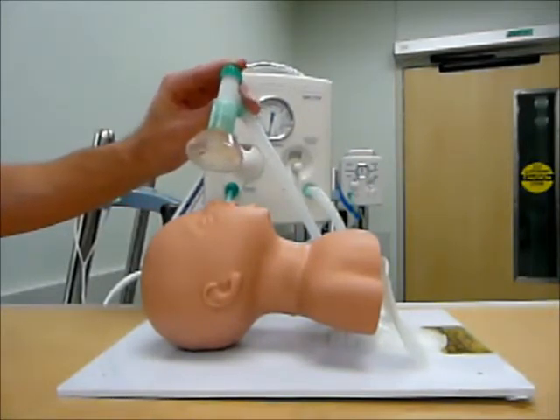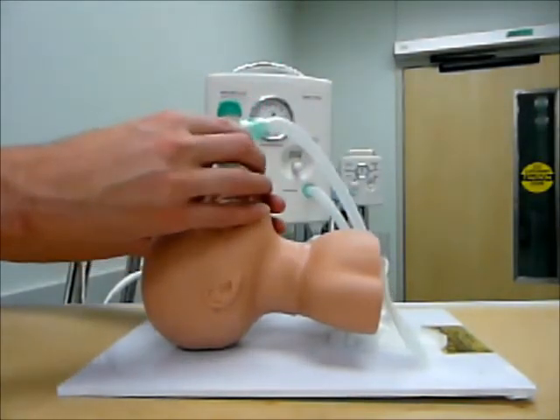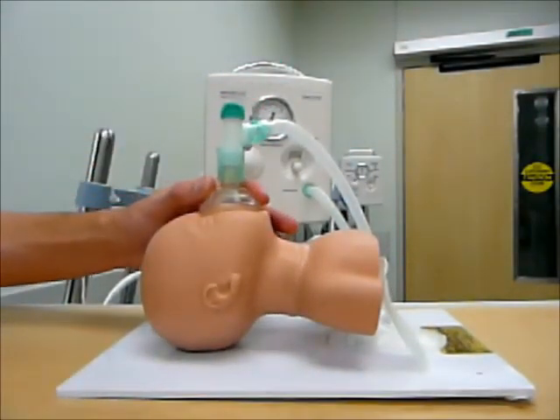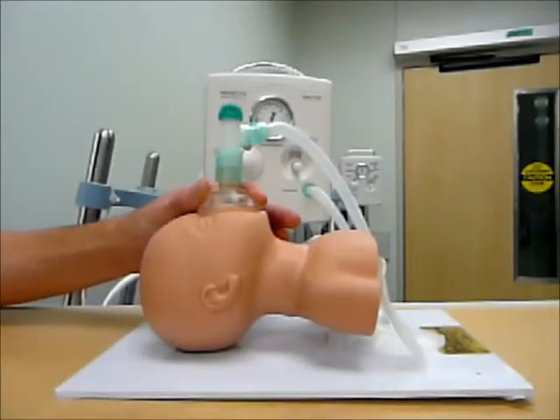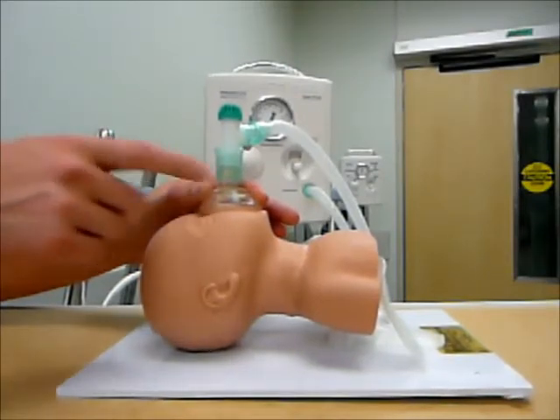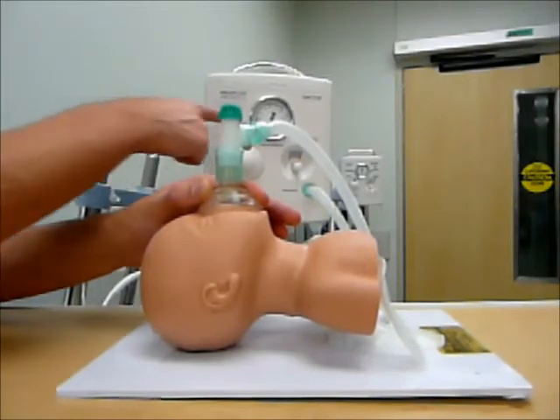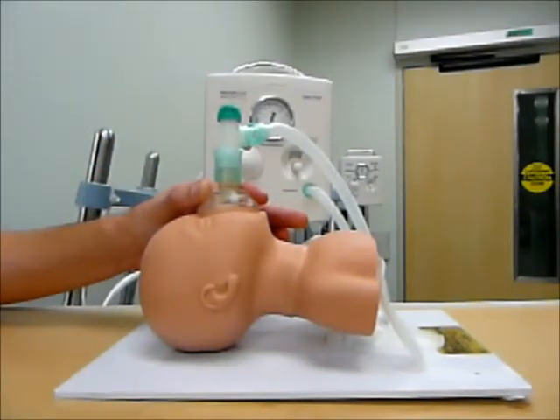The next thing I can do is provide CPAP. To provide CPAP what I want to do is get a nice good seal on my patient with my mask, but I don't actually want to be occluding the cap at the top — doing that will actually provide ventilation and will end up going up to a peak inspiratory pressure, and I don't want to do that. I just want to provide straight CPAP: a nice good seal with my patient and not occluding my cap. And you can see here on my pressure manometer I have a nice PEEP of 5 centimeters of water.